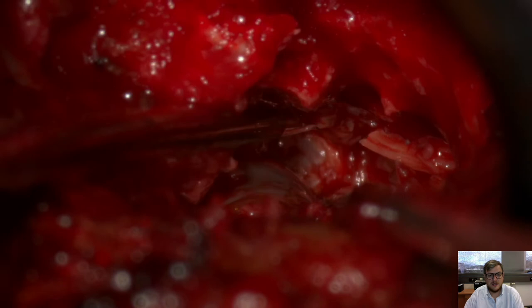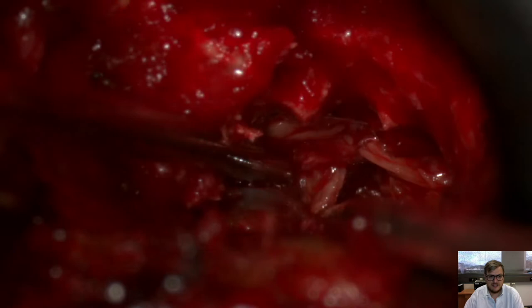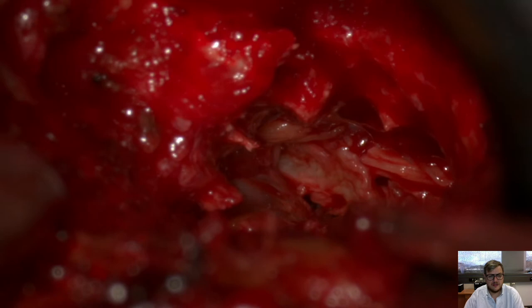Also, here it's a little dark because my hand is blocking the light towards the video stream. But if you use the robotic scope, you will see that this is not a problem at all because you see the feed coming in from two camera systems.